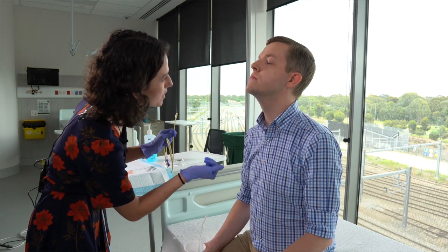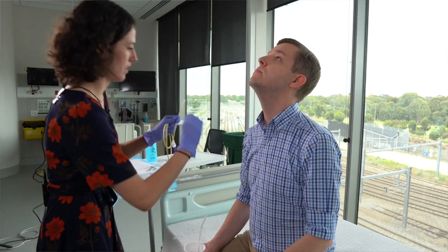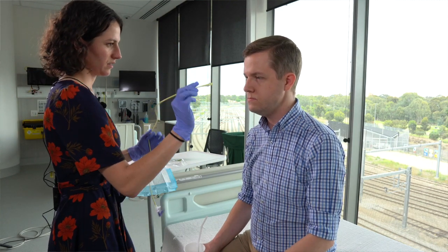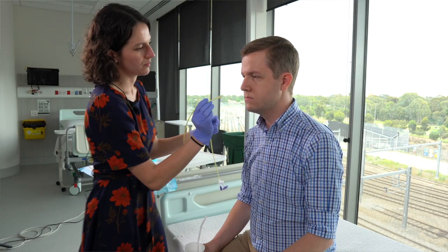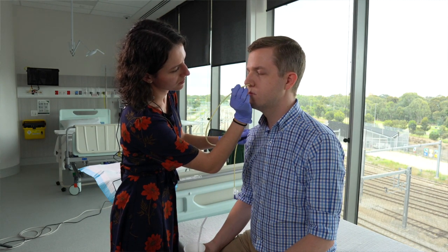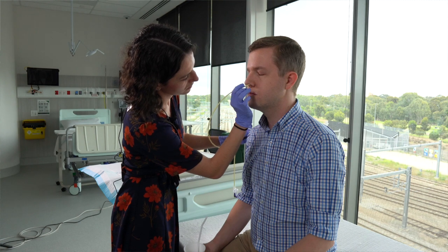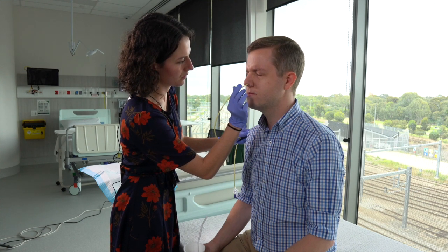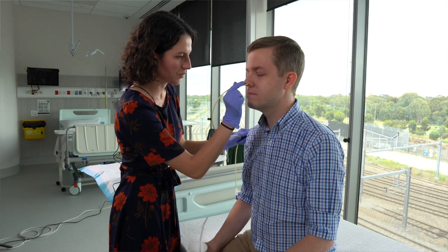Ask the patient to look up so you can inspect the nostril first, then have them relax their head down again. Insert the tip of the NET into the patient's nostril perpendicular to the facial plane until resistance is overcome. This will indicate that the tube has bent inferiorly into the nasopharynx at the back of the nose.